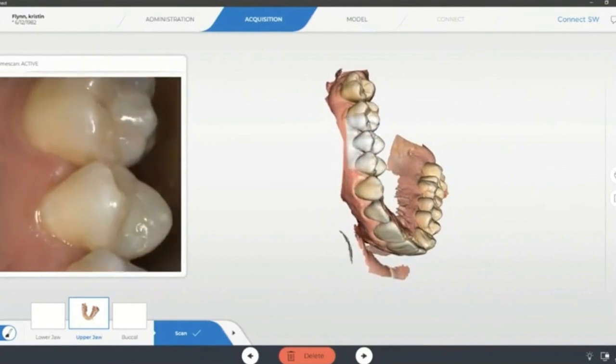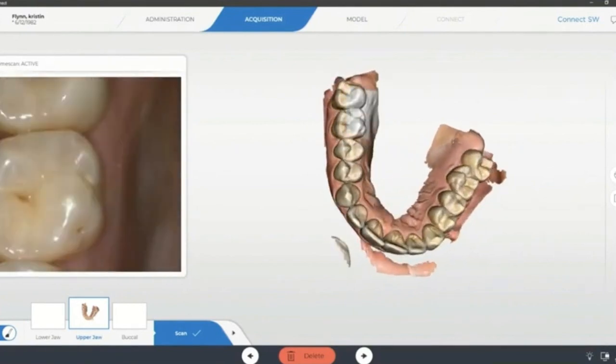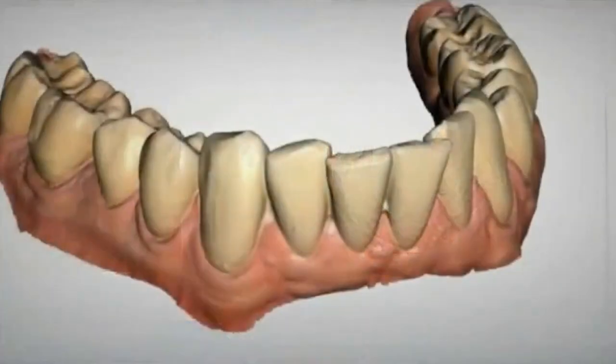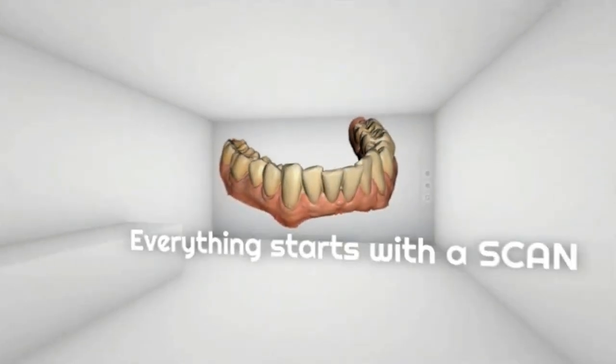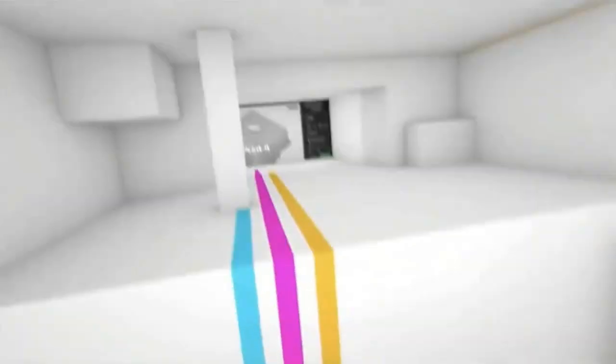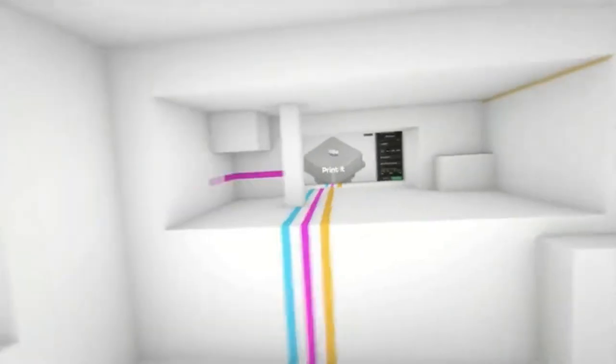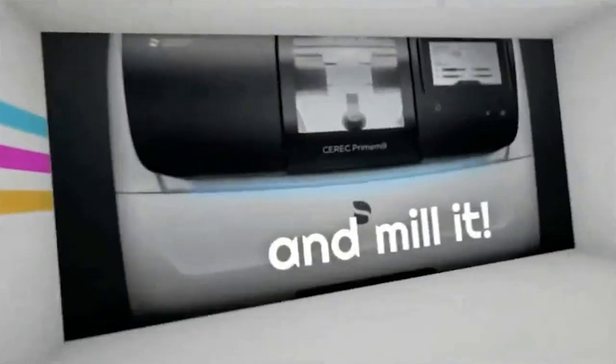And it's not about timing. It's about collecting great data, because once you have that, the software is going to do a great job. So everything starts with a scan. Okay. Without a scan, you absolutely need that. Then you need a lab software that allows you to create an STL file to go to print, or if you have a system, for instance the Primescan family, or the Dentsply family, a full system that you can build, then that is great.